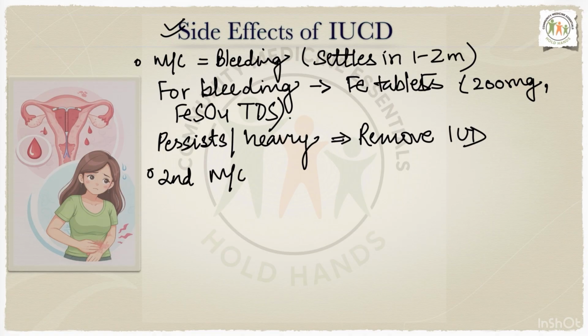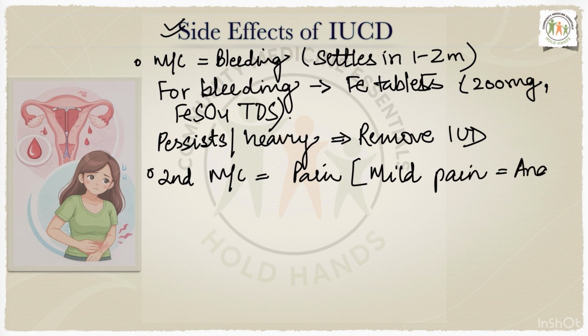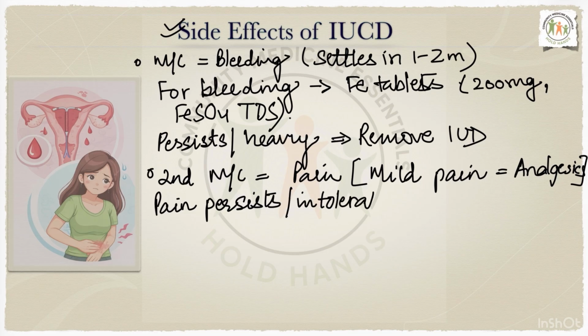Second most common side effect is pain. Mild pain can be managed with analgesics. However, if pain persists or is intolerable, then IUCD removal is indicated.